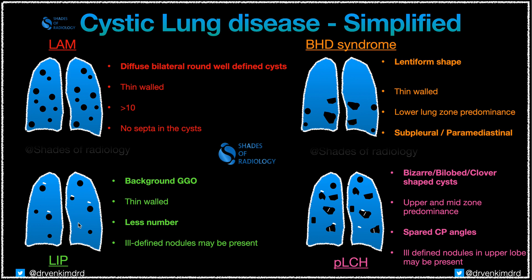Coming to LIP — lymphocytic interstitial pneumonitis — in this case you see few cysts which are less in number and again thin-walled. You can see some amount of background ground-glass opacities in LIP, and sometimes ill-defined nodules might be present. These are the features of LIP.